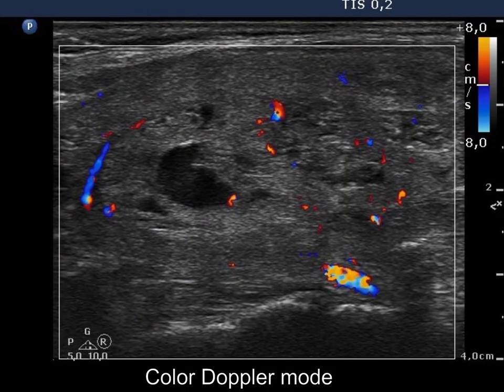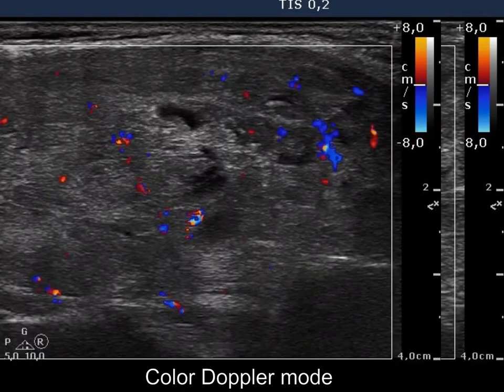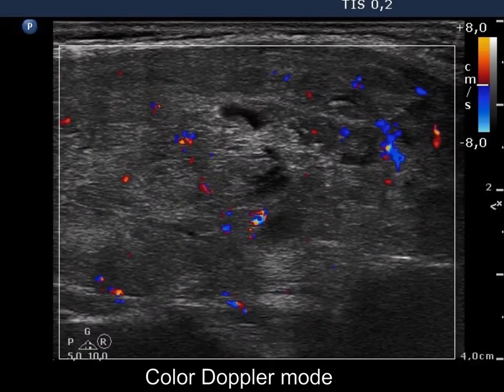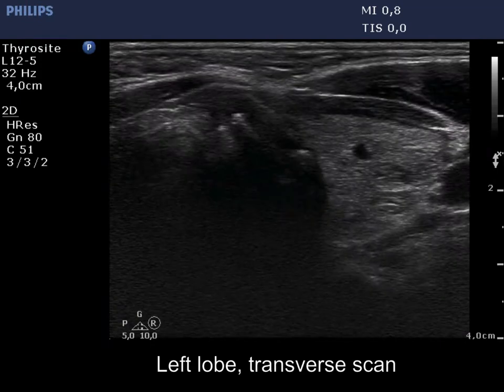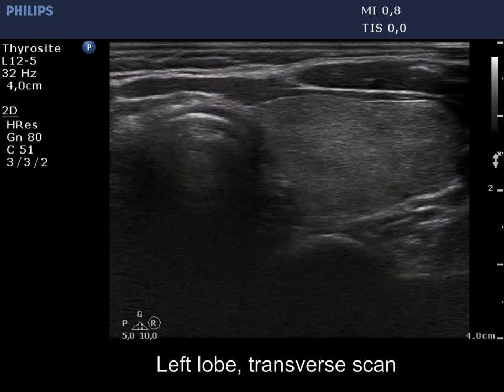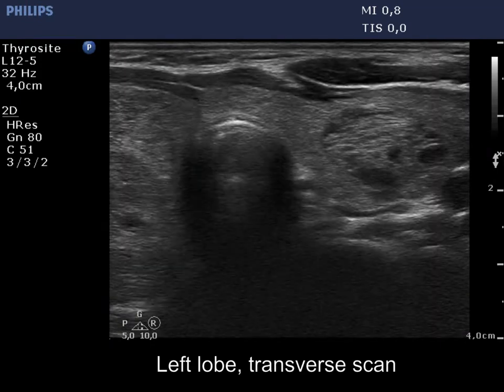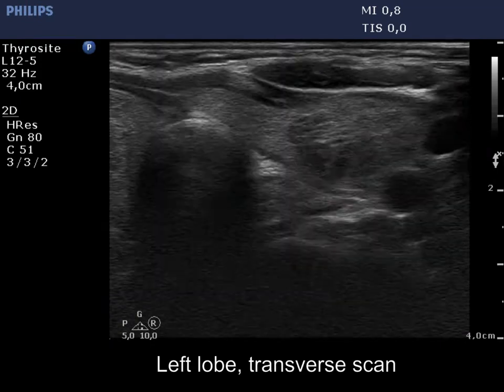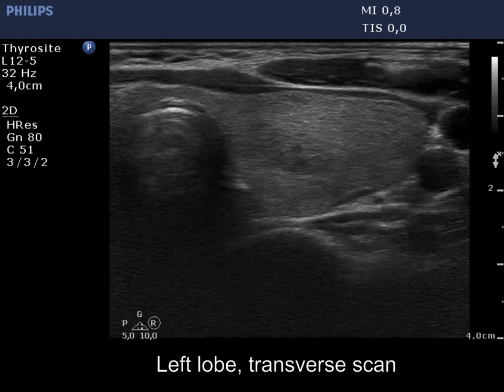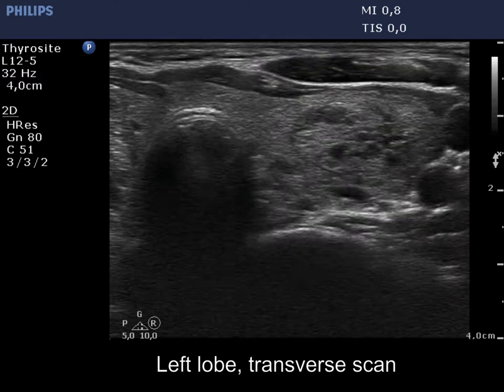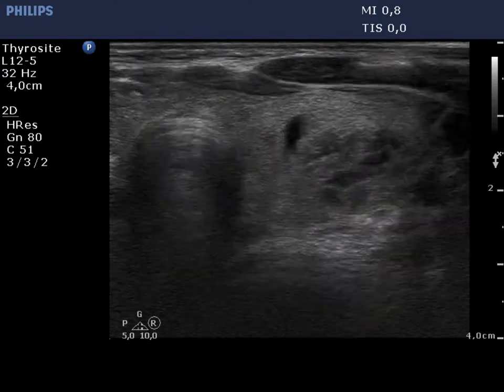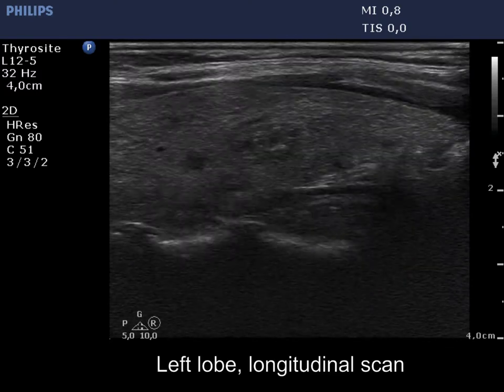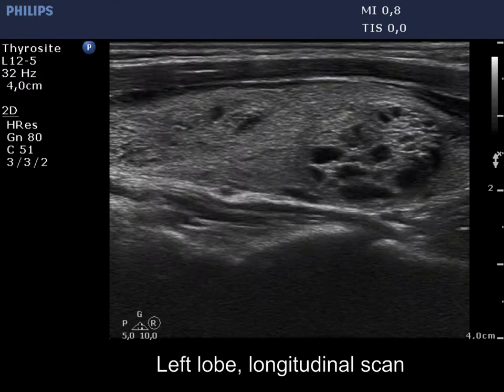Non-specific vascularization can be seen. The left lobe contains multiple nodules with cystic degeneration. The large lesion has spongiform areas, which proportion is close to 50%.